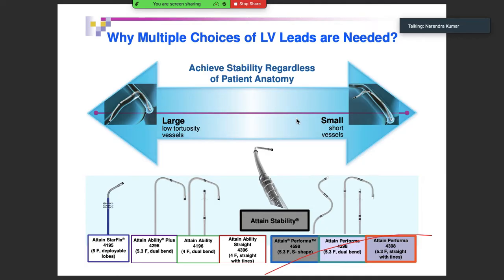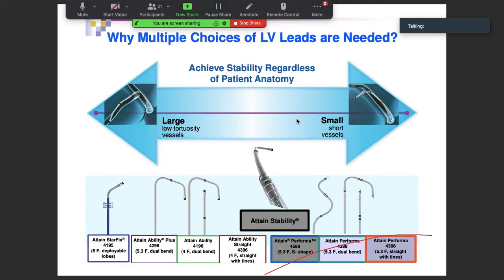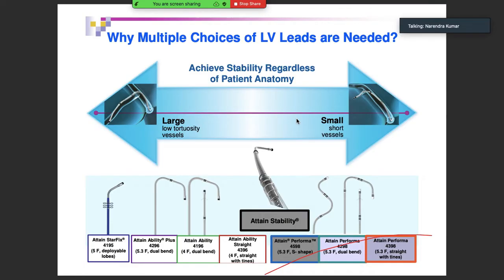Sometimes the right bundle branch block is masking the left bundle branch block, which is characterized by a broad, slurred, sometimes even notched R wave in lead I and aVL, together with a leftward axis deviation, which is frequently noted in the left bundle branch block morphology. Okay, so that is definitely a time one can even think of it, in fact. Any other indications?